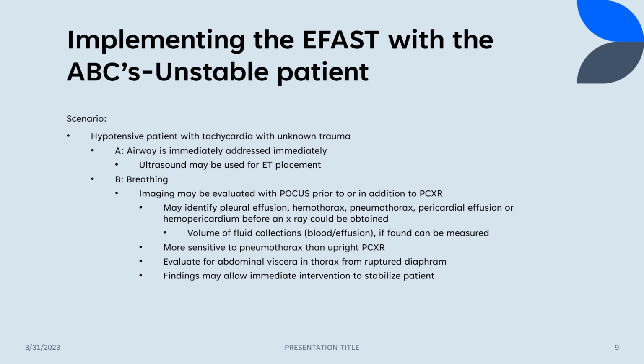And the other benefit of this is that it can detect very, very small volumes of fluid collections. It's much more sensitive than a chest x-ray in that case. We know that most of the time, a patient that's this unstable is probably going to be in the supine position, and we would be getting a portable chest x-ray without the patient erect, making those fluid levels even harder to detect. And so in that case, the ultrasound is going to be quite a lot more sensitive to those fluid levels than our chest x-ray would be. So it's a great option to use instead of or in unison with a portable chest x-ray.